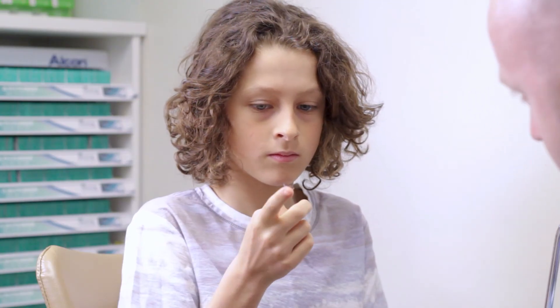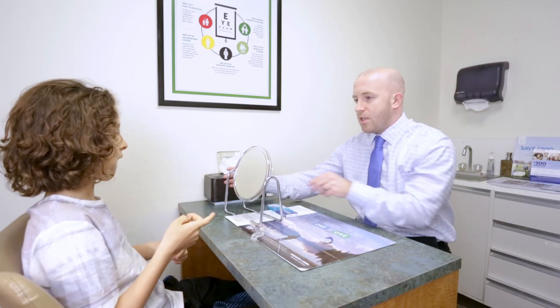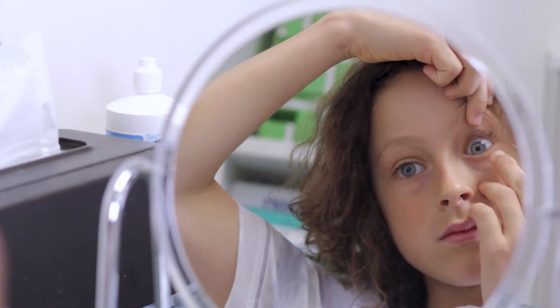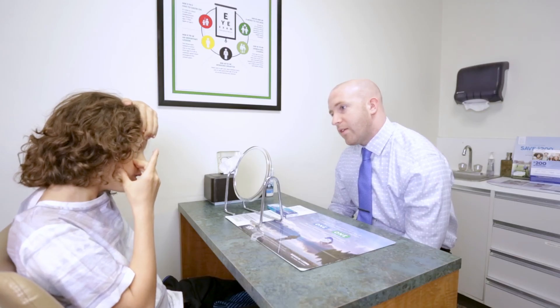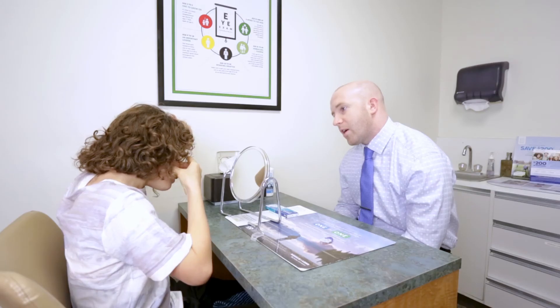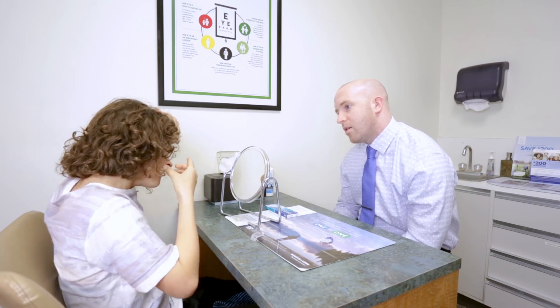It looks perfect. We've got your little station set up here. Go over the top, get that top lid way out of the way — good. Then the other lid way out of the way — good. Keep looking right at it in the mirror — perfect. Try to put it right in the center of the eye. Really good!